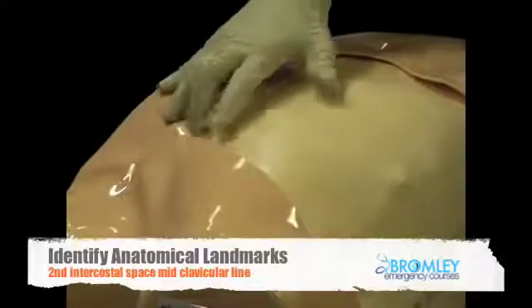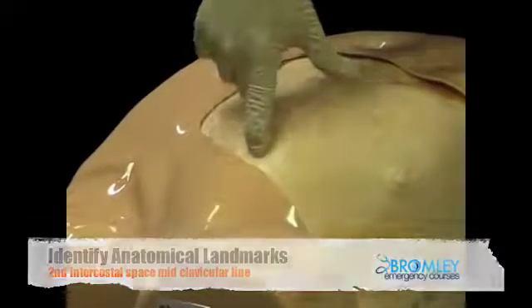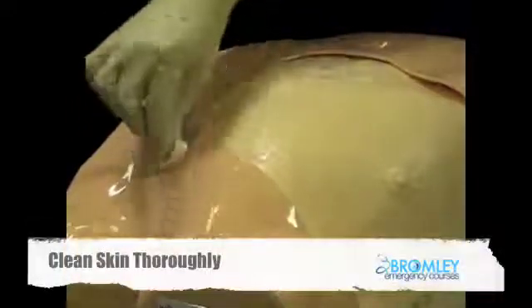Begin by identifying your anatomy and cleaning the area. Mid-clavicular line. I'm going to clean the area with some suitable cleaning fluid.